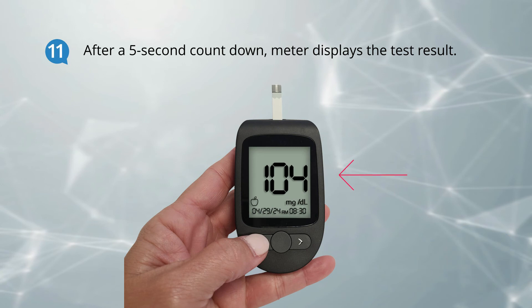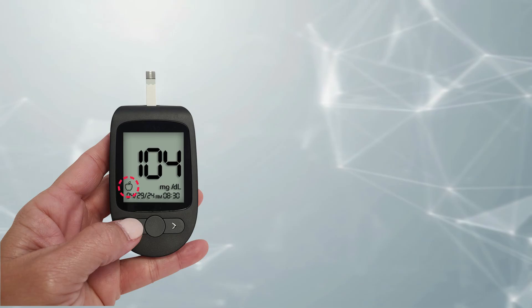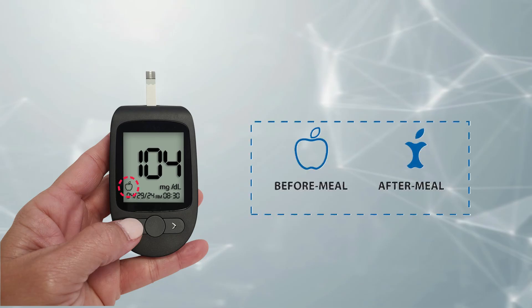This test result is automatically stored in your meter's memory, including the date and time of the test. If you choose to tag your result using a meal symbol, the symbol will be stored in the memory along with your result.